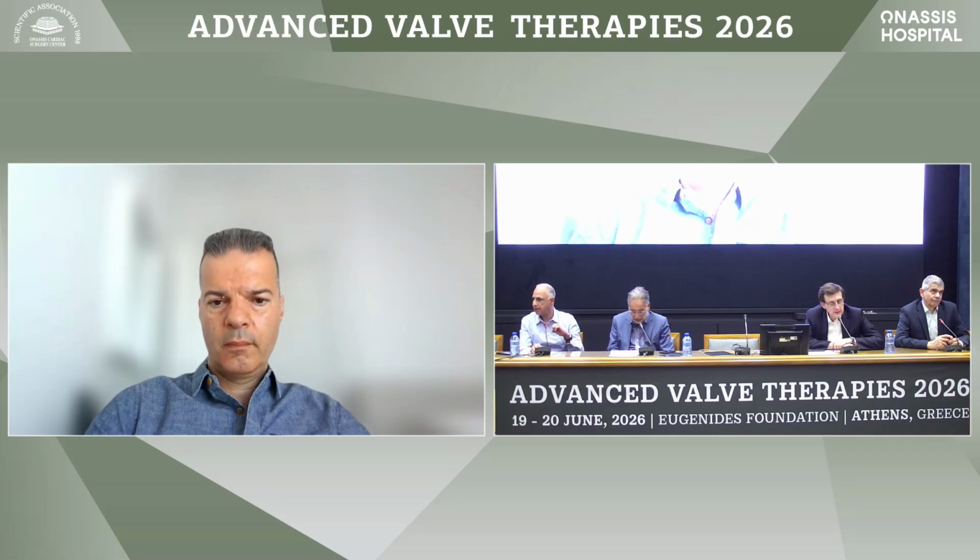But definitely aiming for a clover technique is, I think, our best chance to get a long-term outcome which is suitable and good for the TEER in this condition. Dr. Yakouvou?